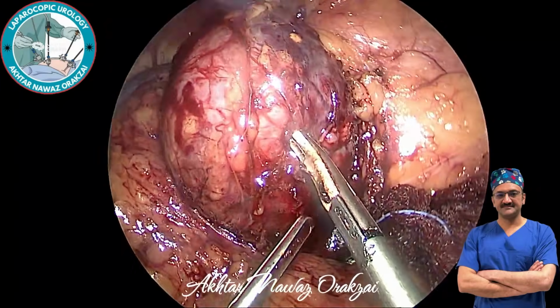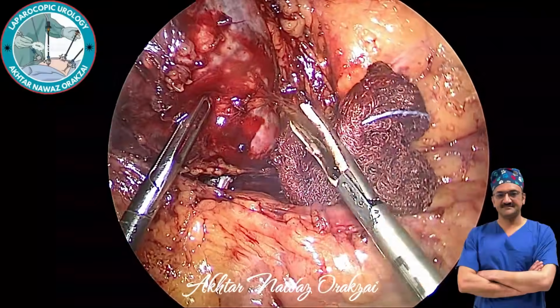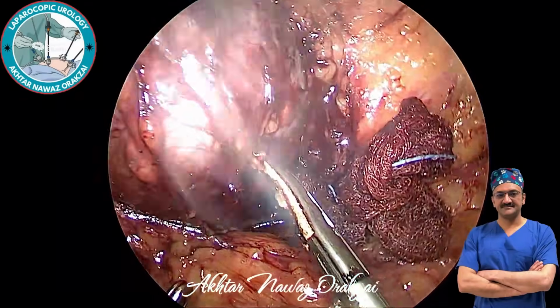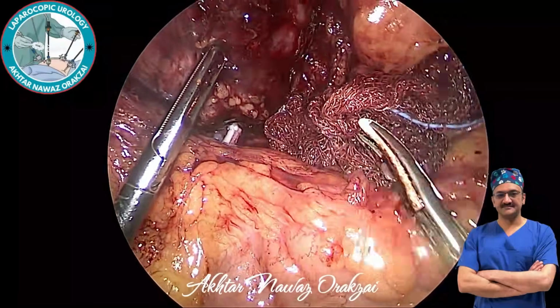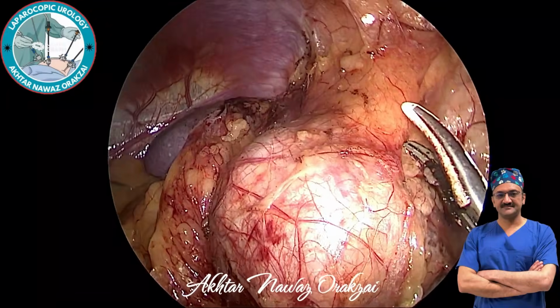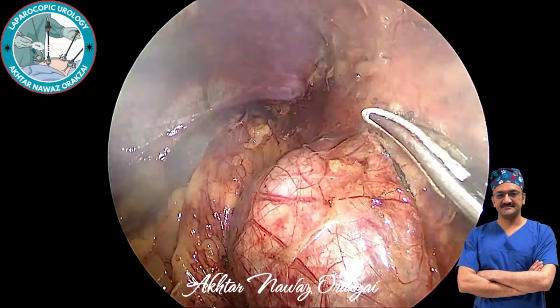So oncological principles have to be followed. The most difficult part of adrenalectomy is separation from the upper pole of the kidney.